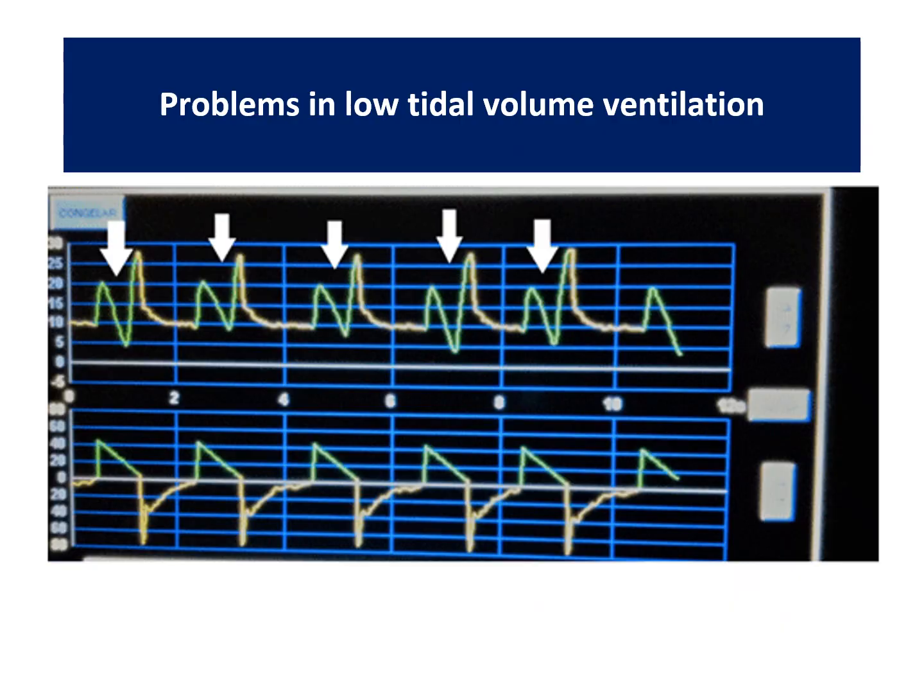So this is how it will be. You have kept the patient on volume control ventilation, and you are expecting that the patient will be happy the moment you put the patient on the ventilator in volume control. And this is what you see. You see that the patient is breathing very rapidly, and these curves are looking very crazy. So this is a classical flow asynchrony.